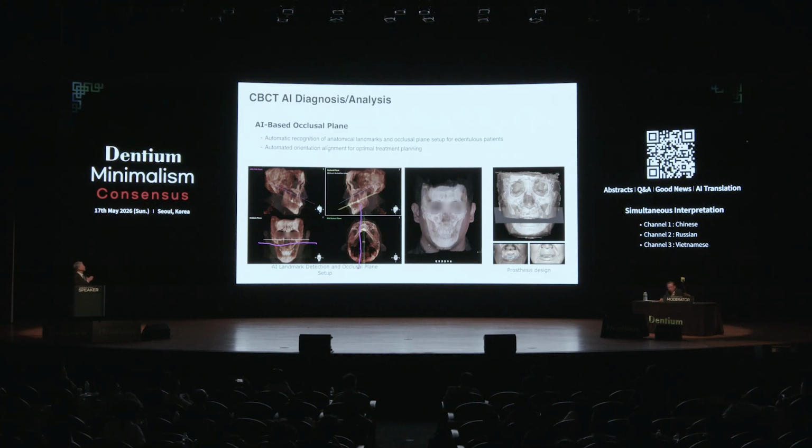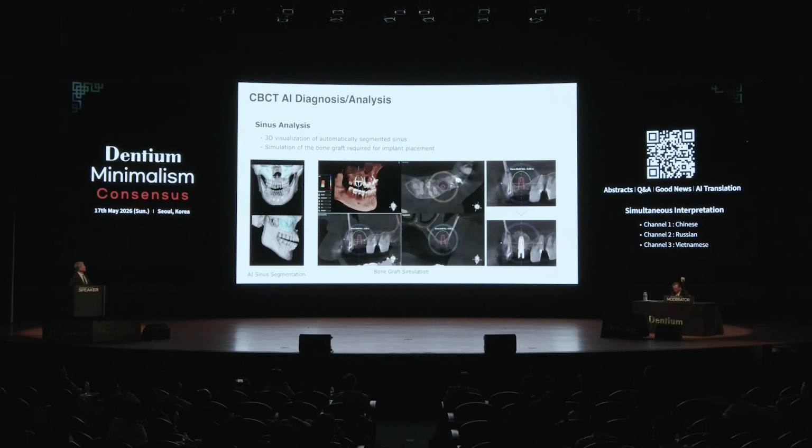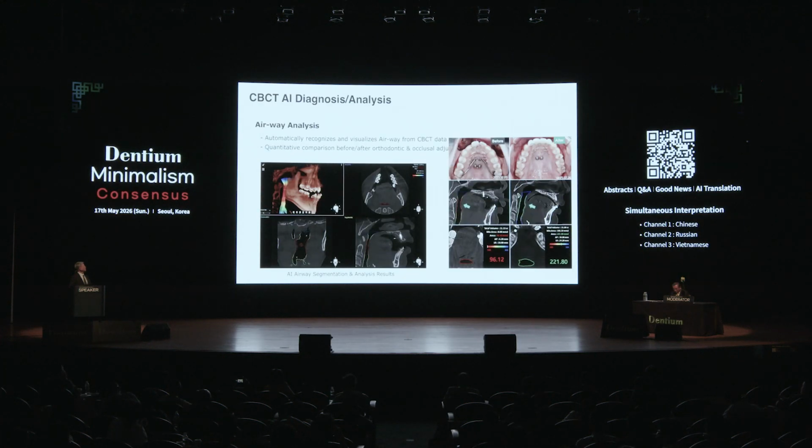However, we have used the facial scanner and the smart design, in most of the cases with mock-ups, with wax or resins, and try-in. But with this algorithm, we can do that without trying in, and we can finish the final processes. So that's the reason we are making a consensus topic with minimalism. Also, with the other segmentation, even into the sinuses, the treatment is very simplified.